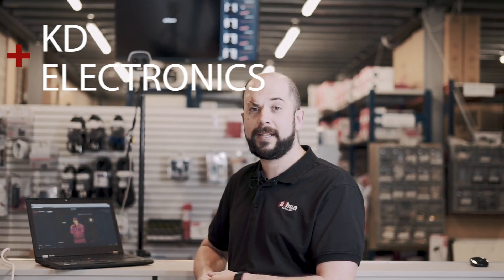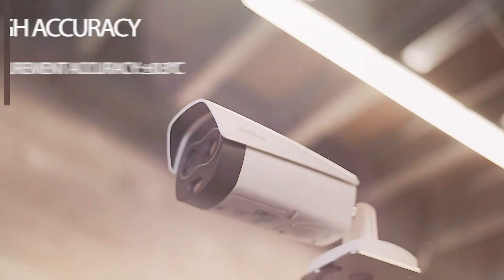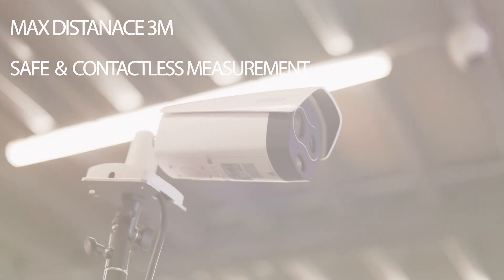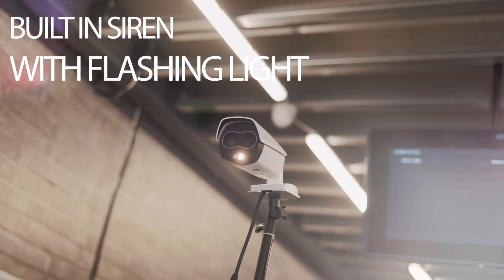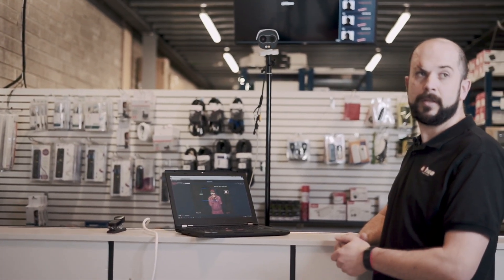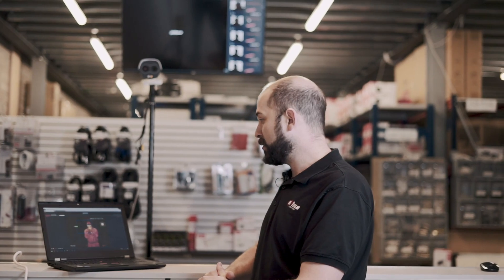Hi, this is Jace Benjamin from Dahua Technology. I'm here today at KD Electronics to demonstrate the new Dahua Body Temperature Measurement System, which uses face detection to lock on to the face of the subject as they pass the camera and measure the temperature from the centre of their forehead.